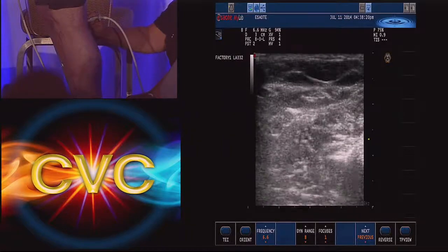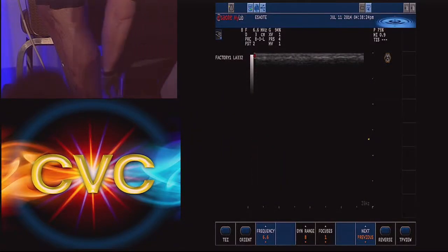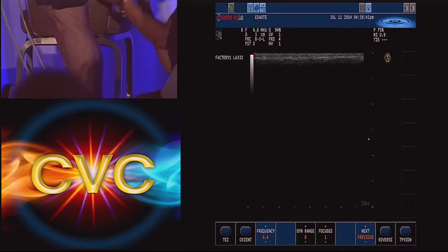Yes. Yeah. You go from the ankle up. You just got to be a little careful, because the reflux in that case is from a perforator into the saphenous below. So let's say my perforator here is incompetent, right? And that's leaking out. And now all this is flooded, and I'm getting issues. This could be absolutely normal.